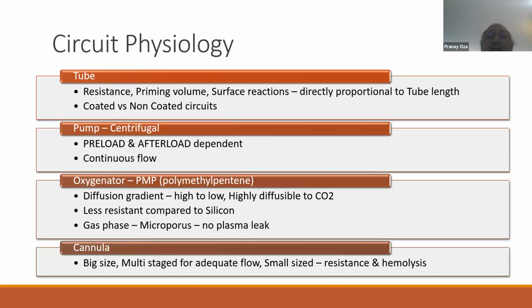Coated versus non-coated circuits. Coated circuits will have fewer surface reactions, while non-coated circuits will have more reactions. With coated circuits, you can think about low-heparin or heparin-free ECMO for some time, while in non-coated circuits, heparin-free ECMO is going to be a little difficult. But definitely there is no study which suggests whether it has a prolonged or better outcome.